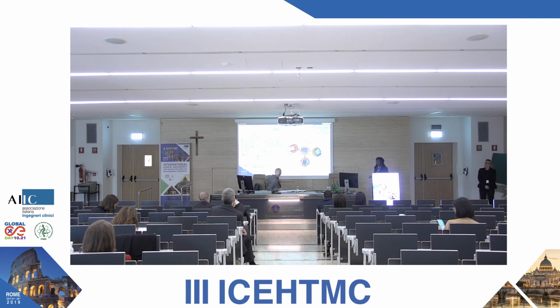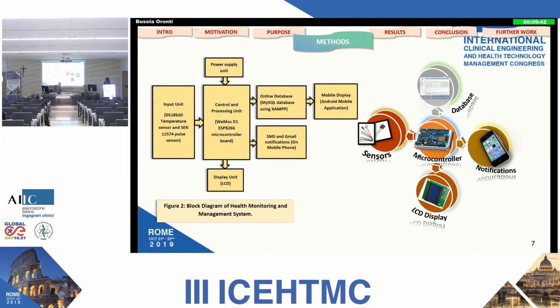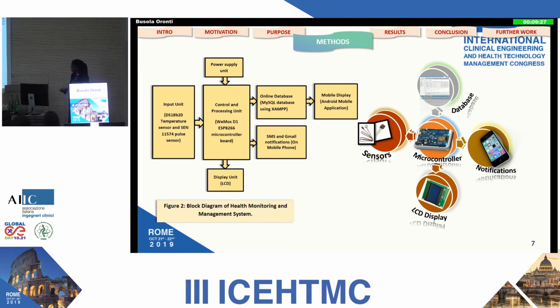Now that is the sensor we use, the DS. That's the name of it, a temperature sensor. We compared a lot of sensors when we were trying to do the design, and because we're also looking at the cost, we had to come to a midway between the two, at least starting, because of course we can take the work further. So we decided that we would use this based on two things, the robustness and the cost.